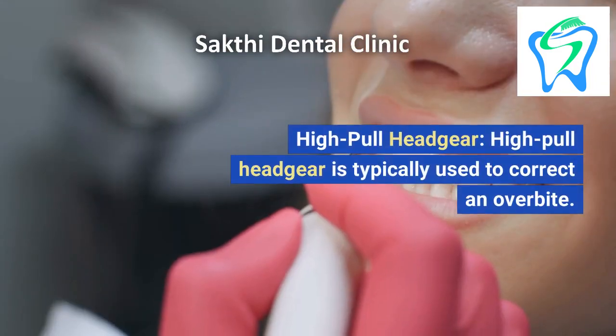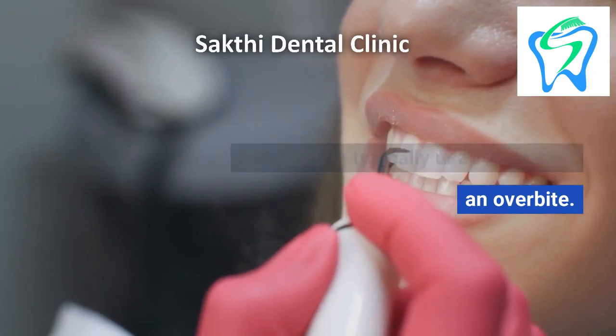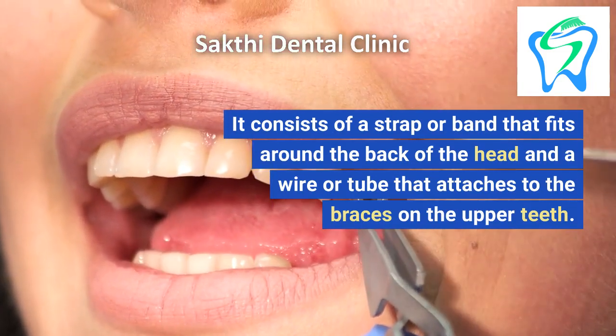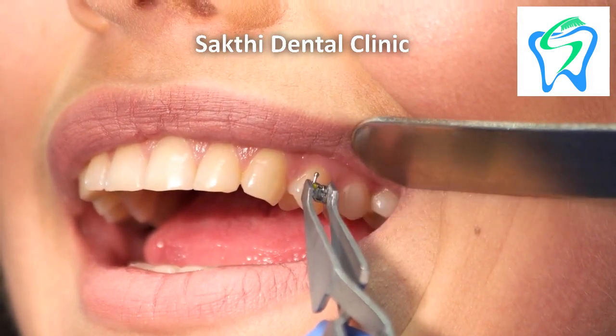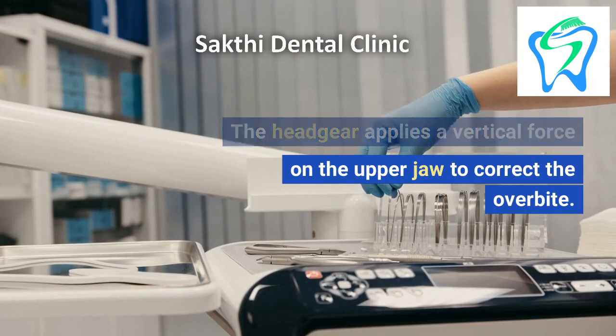1. High Pull Headgear. High pull headgear is typically used to correct an overbite. It consists of a strap or band that fits around the back of the head and a wire or tube that attaches to the braces on the upper teeth. The headgear applies a vertical force on the upper jaw to correct the overbite.